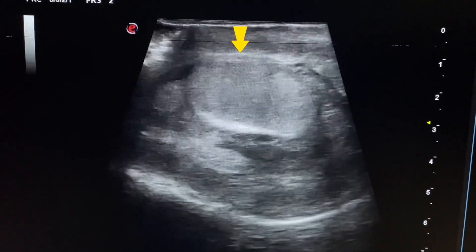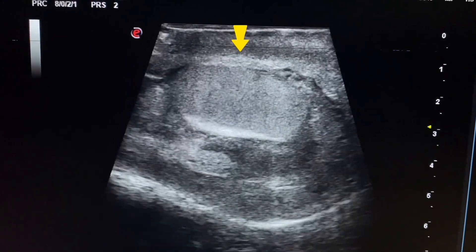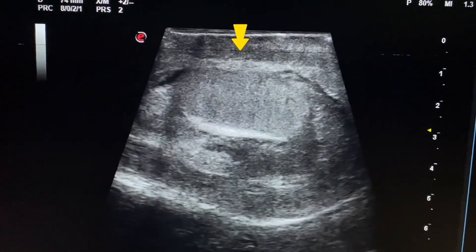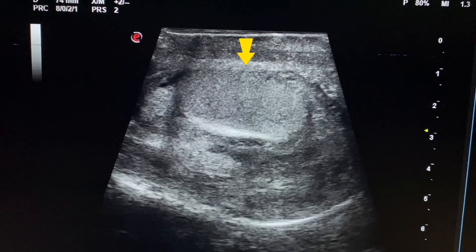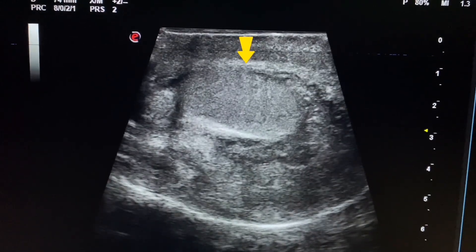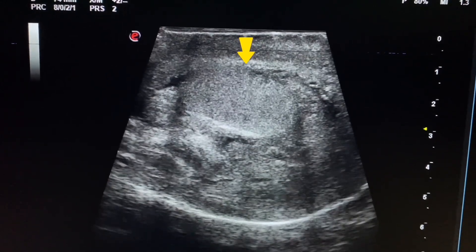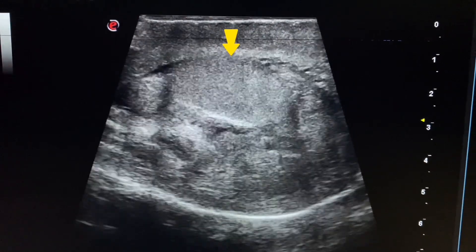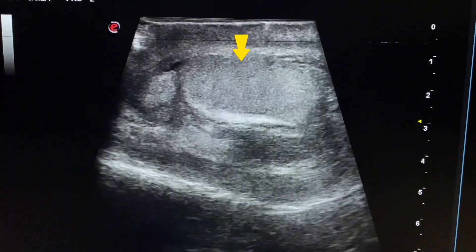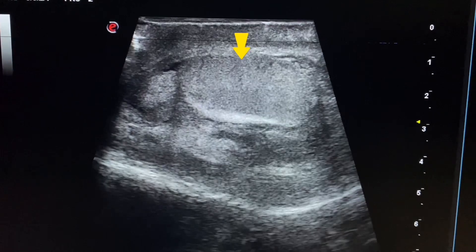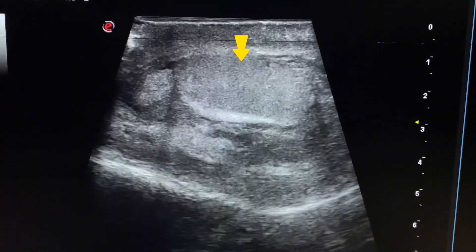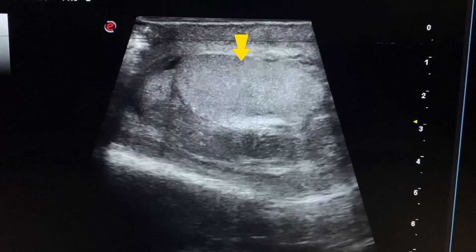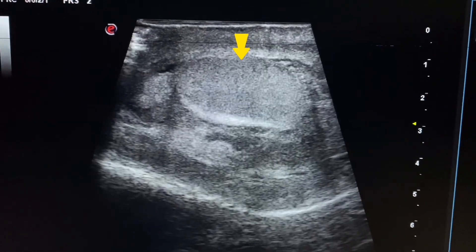We start scanning the scrotum using a linear probe. Here we see the right testis. The right testis shows heterogeneous texture, less echogenic to echogenic texture. The size of the testis appears to be normal.